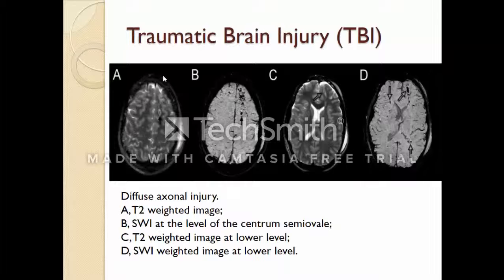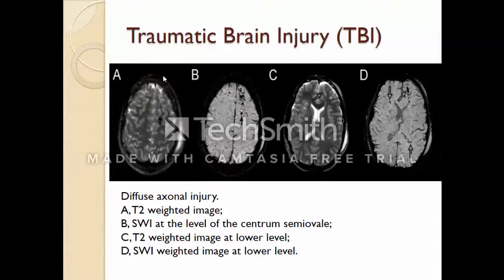Here you can see the diffuse axonal injury, which is a type of brain trauma. In picture A, T2 weighted images visualize this trauma but it is not detailed enough. At the susceptibility weighted image at the level of the corpus callosum we can see the boundaries of the trauma, but at lower levels of the brain this trauma can be observed in a better way. SWI is still advantageous over T2 weighted images since this trauma has other effects at different sides of the brain, as shown with the arrows in pictures C and D.